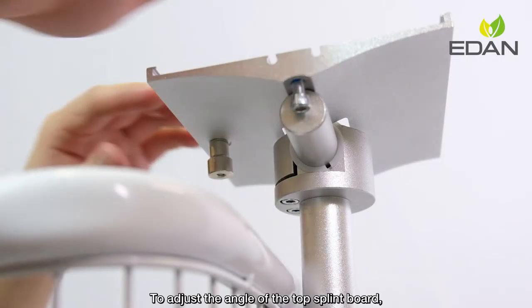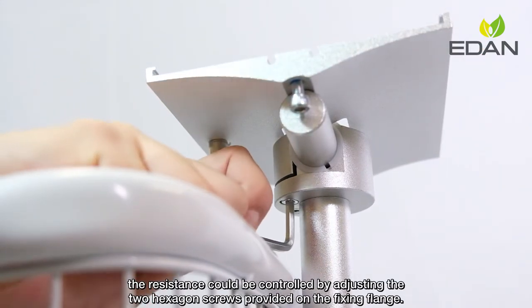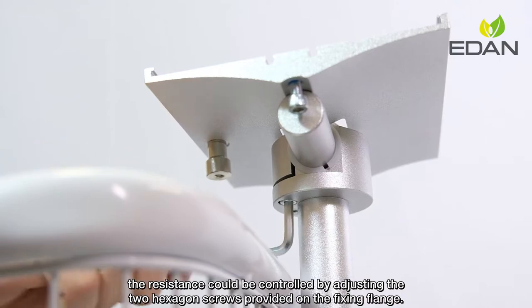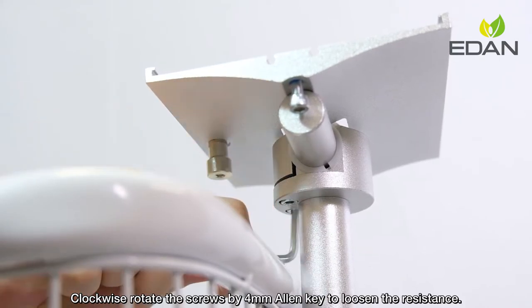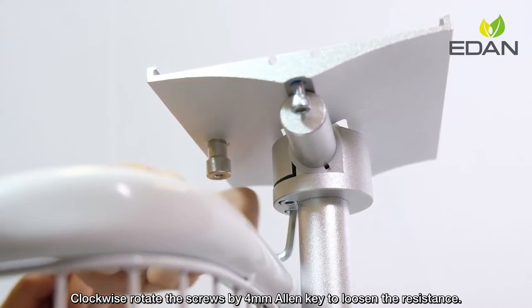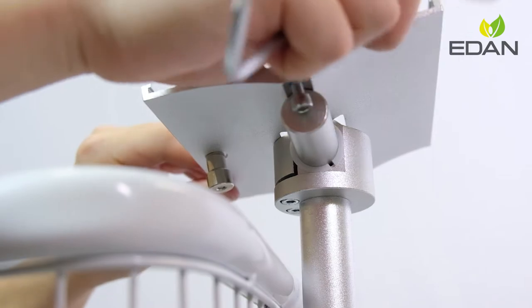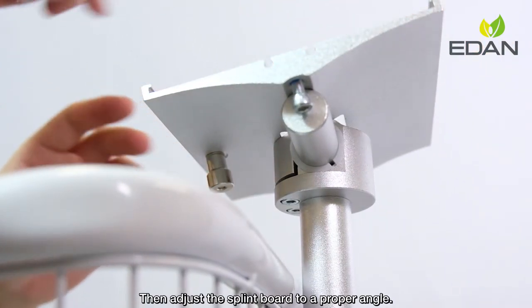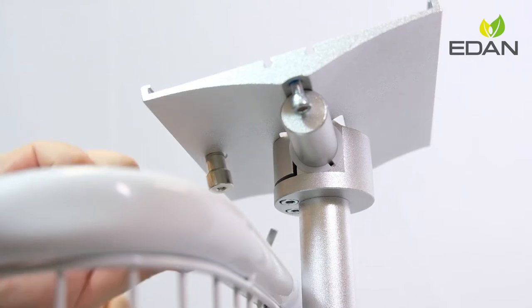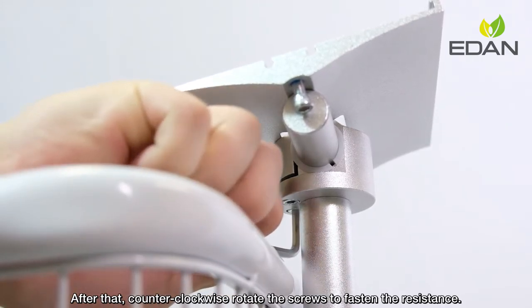To adjust the angle of the top splint board, the resistance can be controlled by adjusting the two hexagon screws on the fixing flange. Clockwise rotate the screws with a 4mm Allen key to loosen the resistance, then adjust the splint board to a proper angle. After that, counterclockwise rotate the screws to fasten the resistance.